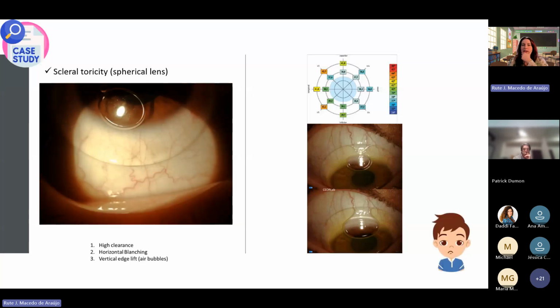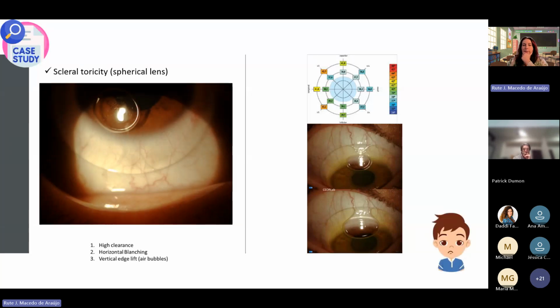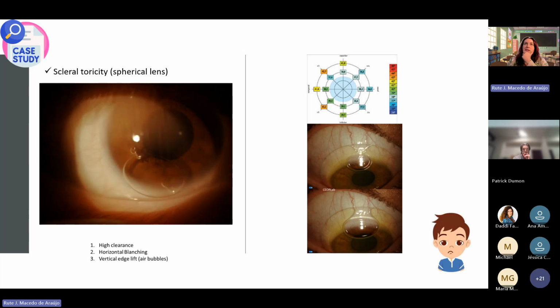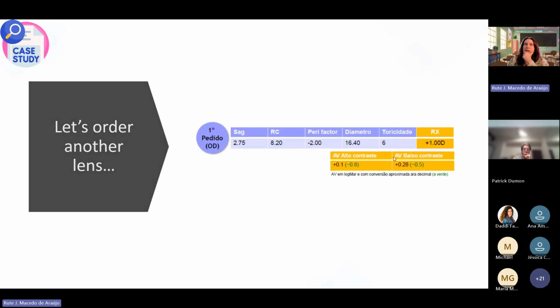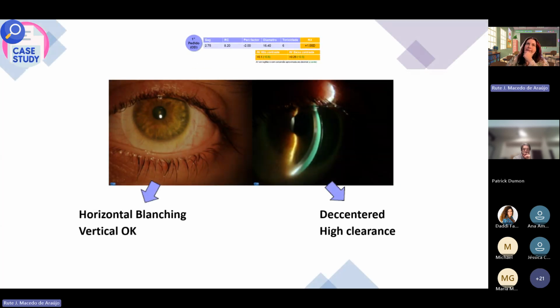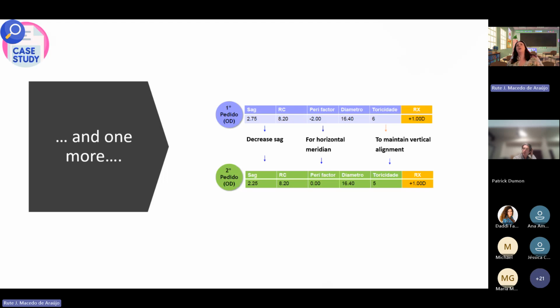And the patient was starting to feel very anxious because there were many lenses already. And we needed to order another lens. And now I changed the toricity of the lens. And what happened? Horizontal blanching, the vertical meridian now was okay, but the lens was very decentered. We had a high clearance in this case. The patient was not very happy with that, but we needed to order another lens.